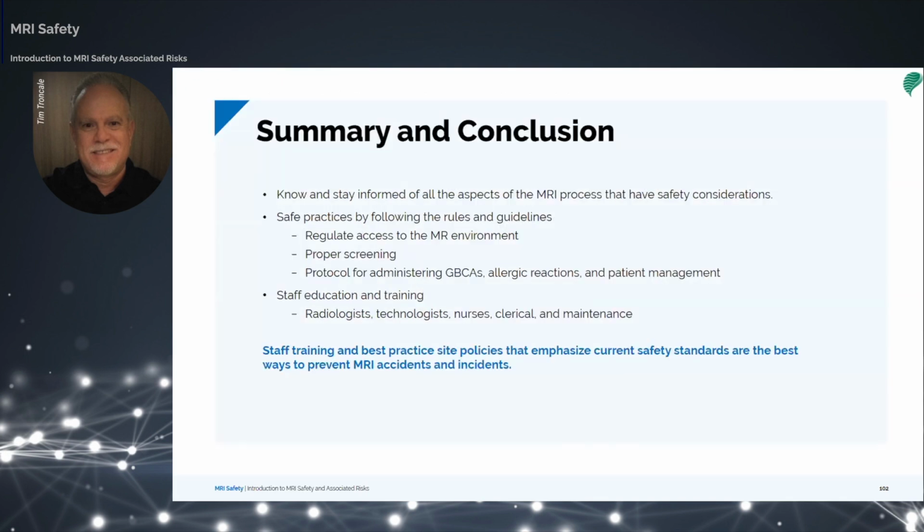So finally, to summarize and wrap up this presentation on basic MR safety, it is extremely important to know the principles of MRI and each component of the imaging process that has safety considerations, what those considerations are, and how to minimize and ultimately avoid them. Safety rules and policies help to define the training required of all people working near the MR area or having the potential to work in that area. Establishing best practices such as screening forms and procedures and protocol for dealing with patients with sensitivity to contrast helps to minimize risks and make the entire process safer for everyone involved.